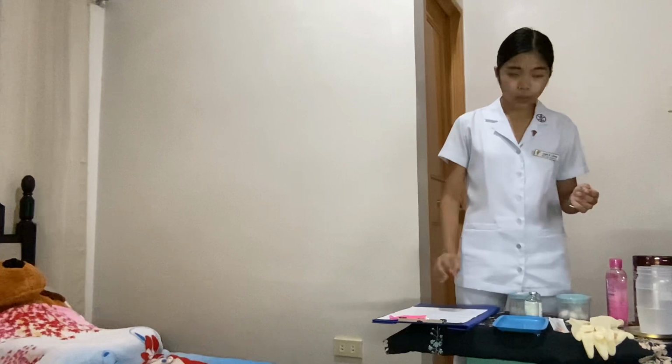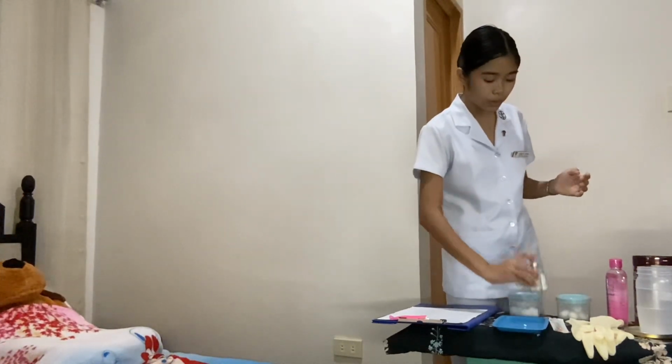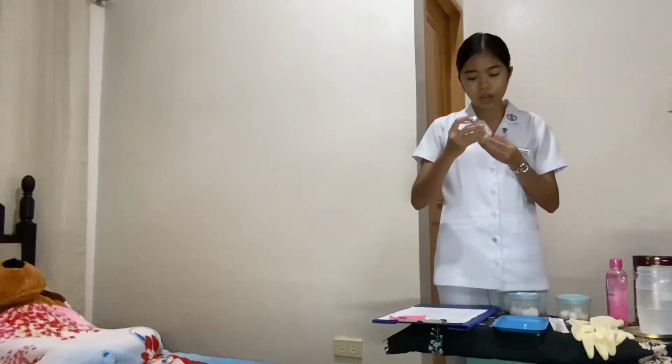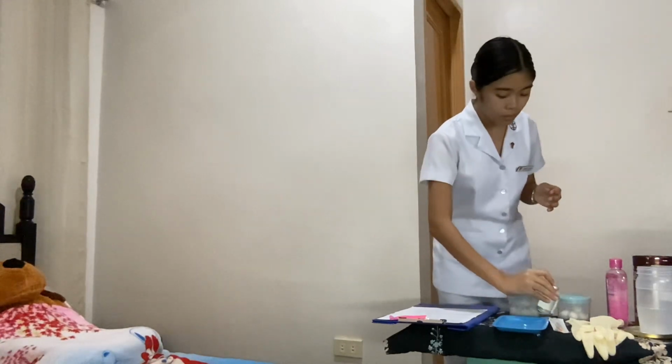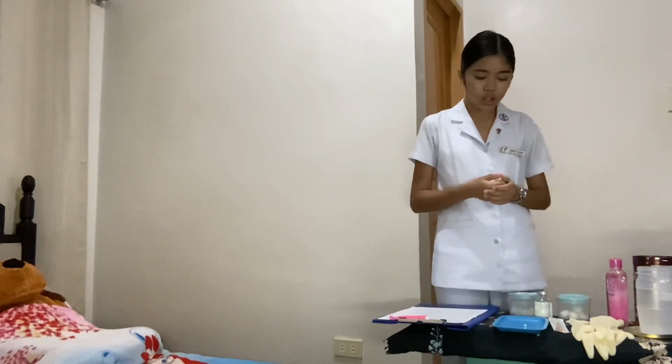So the next thing we're going to do is also to check the name on the label of the medication. So we're going to take this to check if the right medication will be administered to the patient. Also, as you inspect the label of the medication, you should also check the expiration date of the medication to make sure that the medicine is not yet expired before it will be administered to the patient.